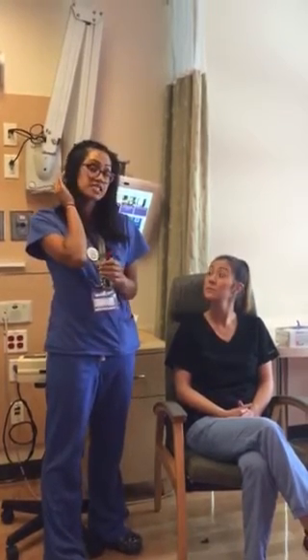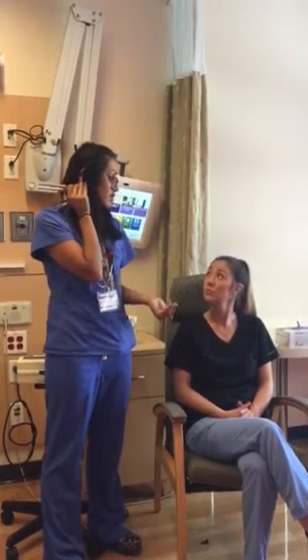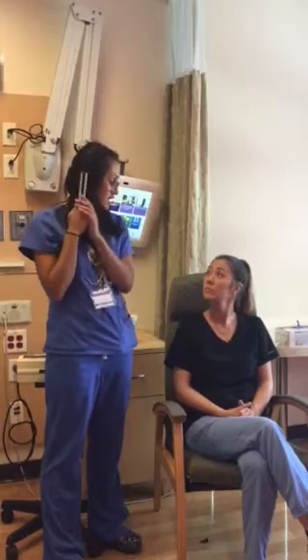And now we're going to check for the Rinne test, which tests for air conduction versus bone conduction, and I'm going to do the same thing. I'm going to hit the tuning fork, but this time I'm going to put it on the bone behind the patient's ear, and that'll test for the bone conduction. And Tiffany, you'll tell me when you can no longer hear it, and then I'll put it beside your ear, and I want you to tell me when you can no longer hear it. Okay. Okay? And you'll do this for both ears.